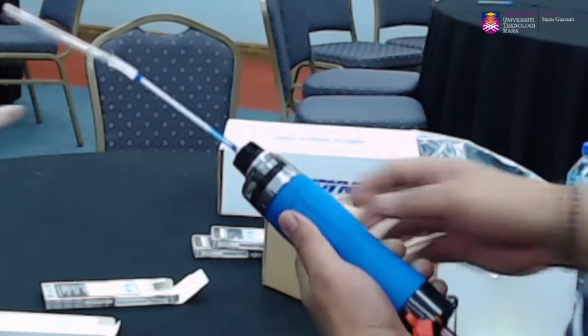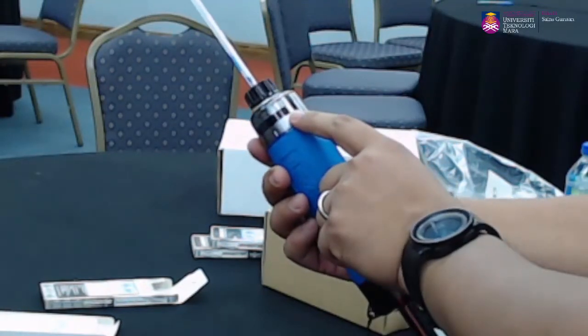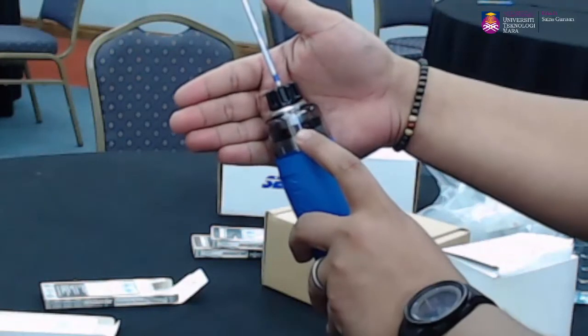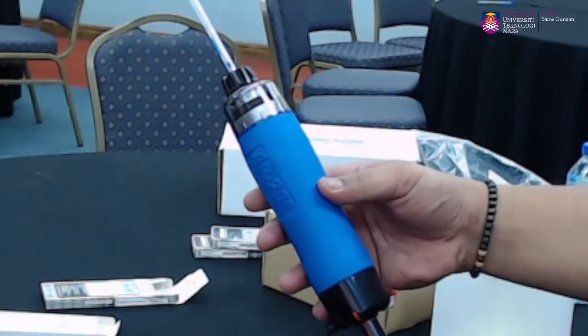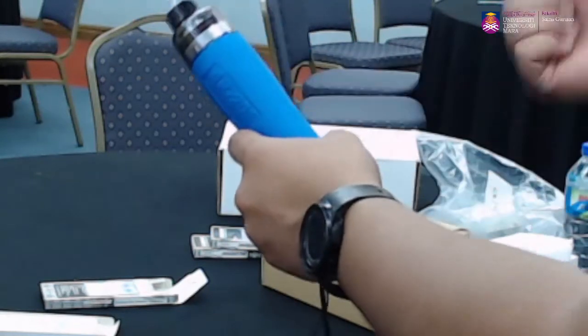Okay, so daripada indikator ni pun dia dah masuk. So nanti dia akan keluar warna merah lah once dia dah habis for 1 minute. Lepas tu sekarang indikator kan on. So means after 1 minute kita boleh turn it to 90 degrees.